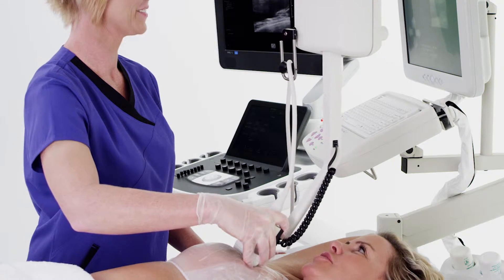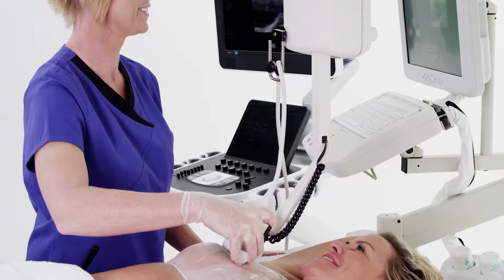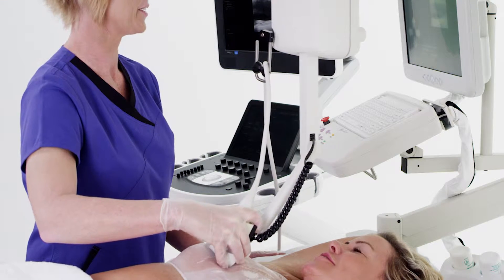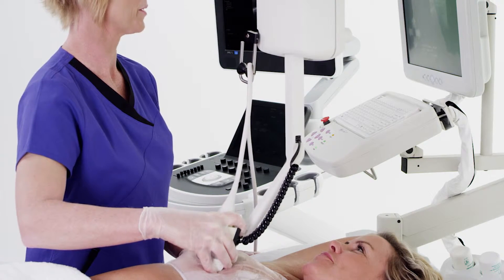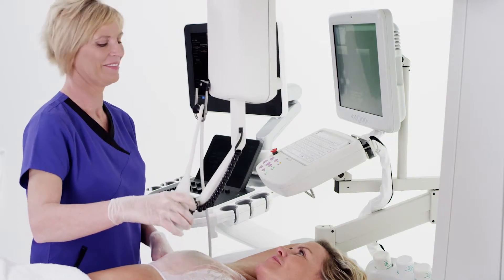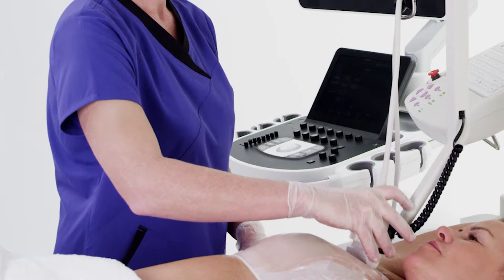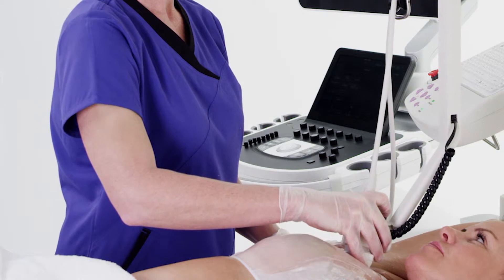With the assistance of the technologist, the computer-controlled ABUS wand moves from the top of your breast to the bottom of your breast, taking pictures of your breast tissue and recording these images for later review by your radiologist. Once the ultrasound wand reaches the bottom of the breast, the process repeats — the ABUS system moves the wand back to the top of the breast and over, just slightly, to capture the next row of images.